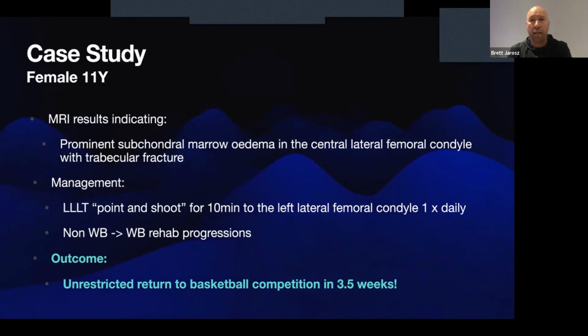So applying the laser, because the rehab exercises don't speed up fracture healing, the only thing we can deduce there is the laser. It's the only thing I can. Some of you guys might have other mechanisms and thought processes there, or hopefully the majority of you are in agreement with me. So the only thing that changed there was me applying that laser, and it accelerated my daughter's healing.